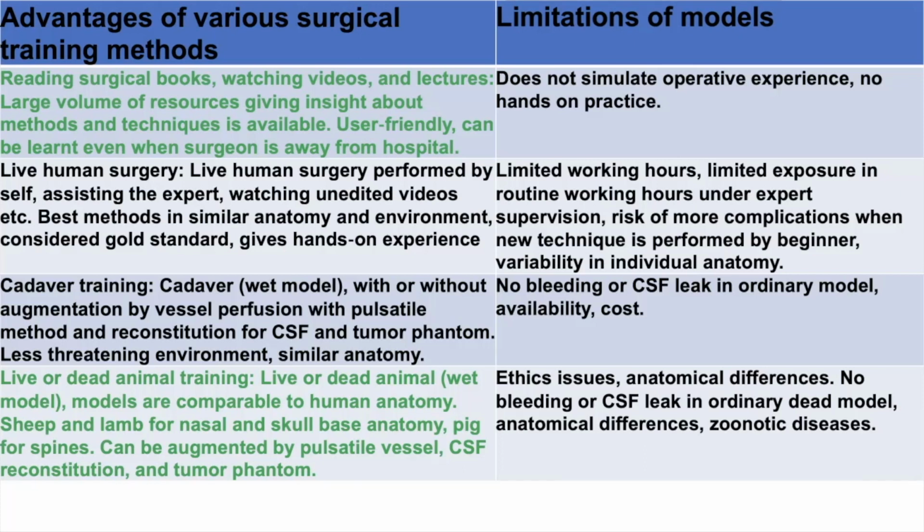The limitations are there are ethical issues, there are anatomical differentiations, there is no bleeding or CSF leak in ordinary animal model, and there may be a risk of zoonotic diseases.